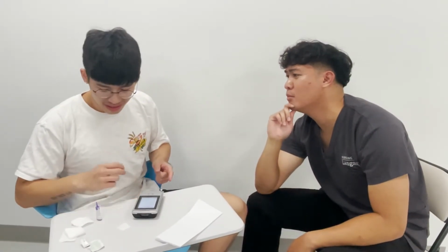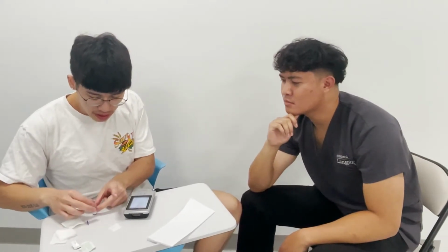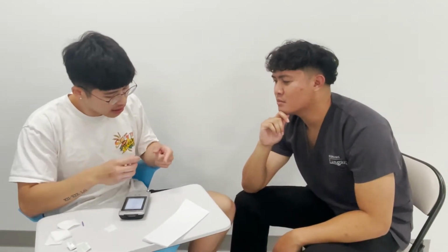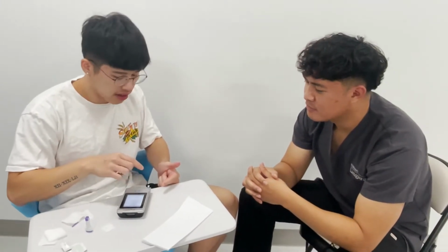So now that you cleaned your finger and let it dry, what's the next step? So I have the lancet here. So I'm gonna open it up. I've chosen the finger I'm gonna do, and on the side. Yes. So let's get ready here. Okay. That one hurts. I'm gonna wipe off the first drop of blood because I don't want the germs to go in here. Excellent.